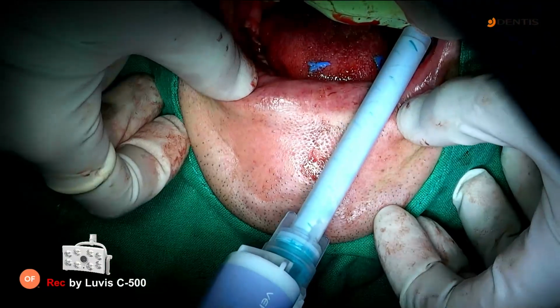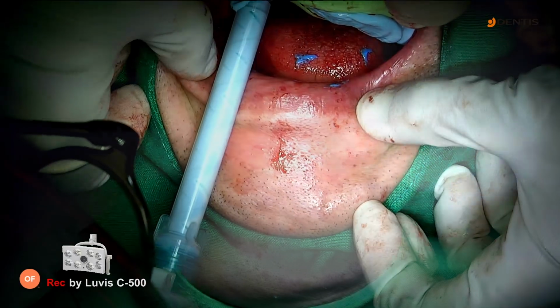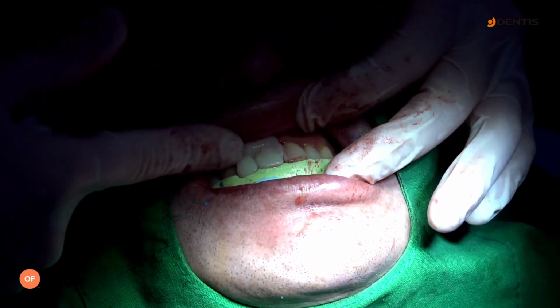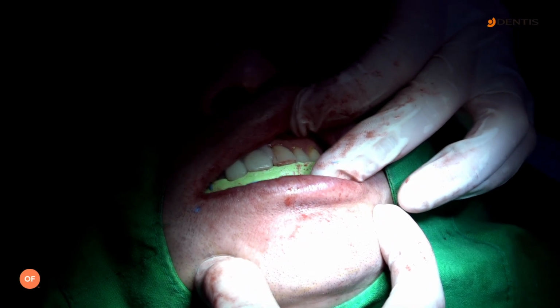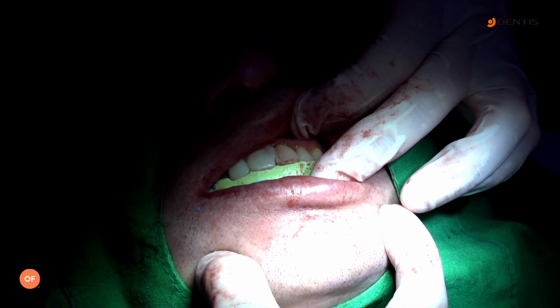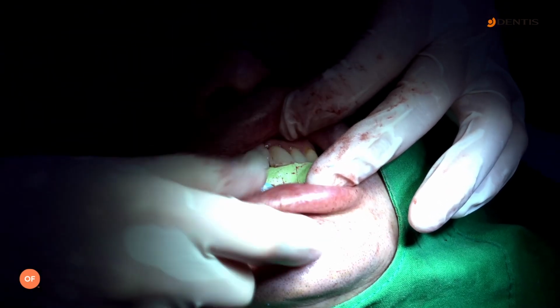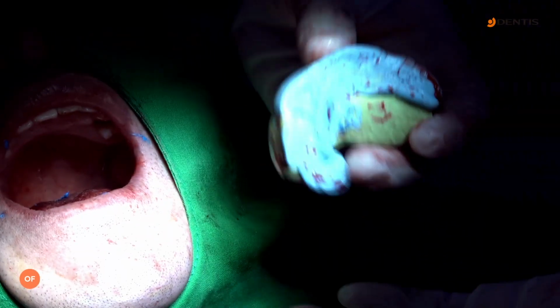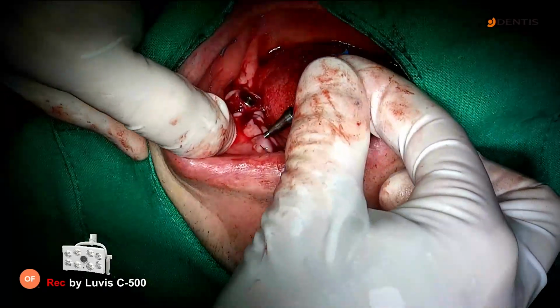And then this is the registration after surgery without anything here. I have the upper jaw information with the immediate denture. I have a lower jaw impression taken at the fixture level with the Dentis SQ transfer coping. I have a bite registration. That means we can make immediate loading. Okay, I finished with the healing cap reinsertion. I really appreciate the patient.